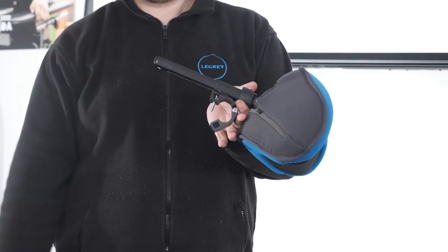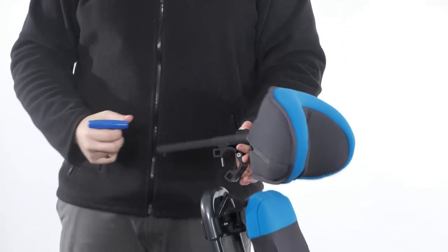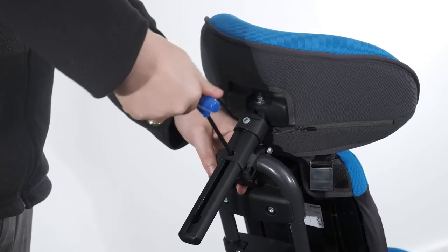Attaching the headrest. To attach the headrest, ensure the clamp is open by loosening the bolt and releasing it from the other side of the clamp. Place the clamp over the top bar of the backrest and centralise. Clamp together by using the Allen key.